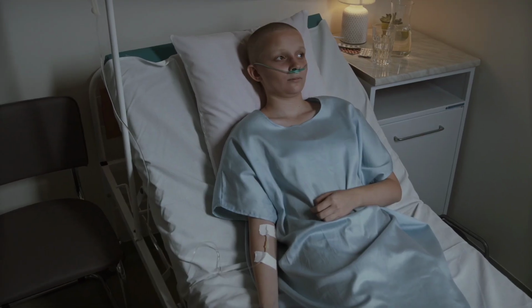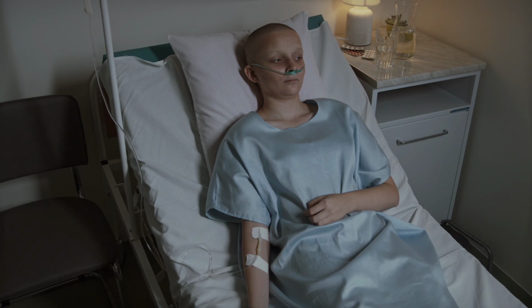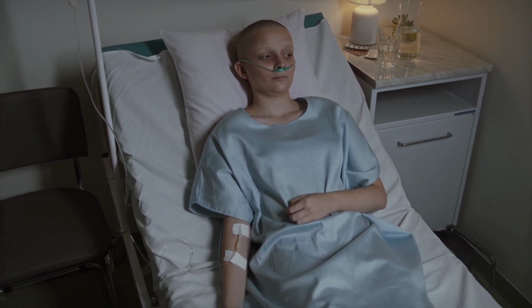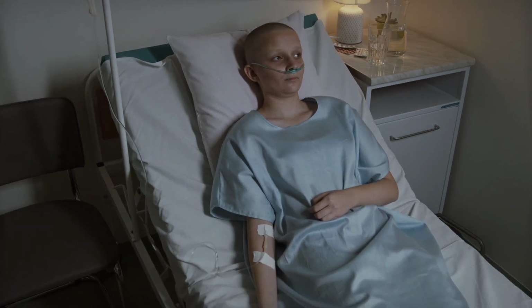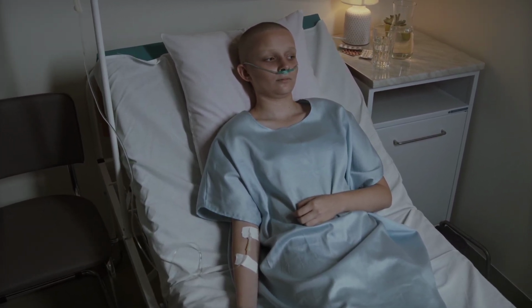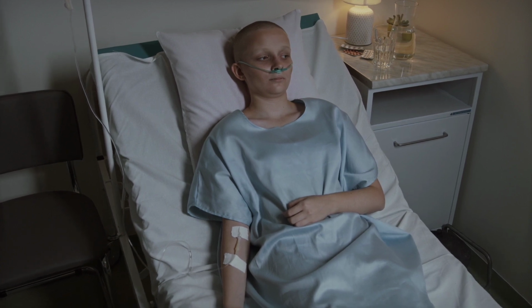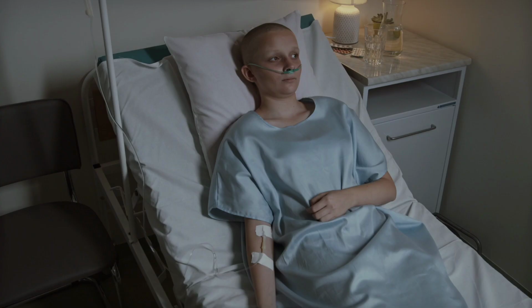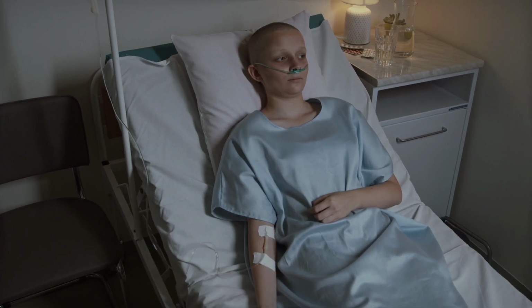Patient positioning and cannula placement. Ensure the patient is in a comfortable position, typically sitting upright. Position the nasal cannula correctly, ensuring it fits snugly but comfortably in the patient's nostrils. Check for proper alignment and absence of obstructions in the nasal cannula tubing.